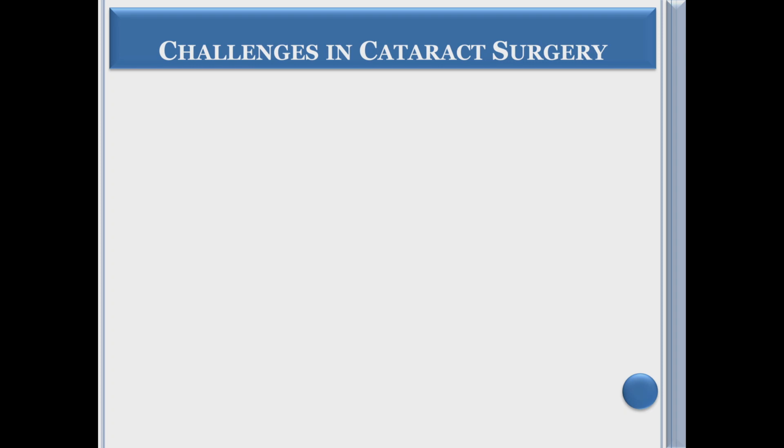So we'll be dealing with three such sets of scenarios: cataract, cornea and refractive. And both of us will be handling different scenarios.